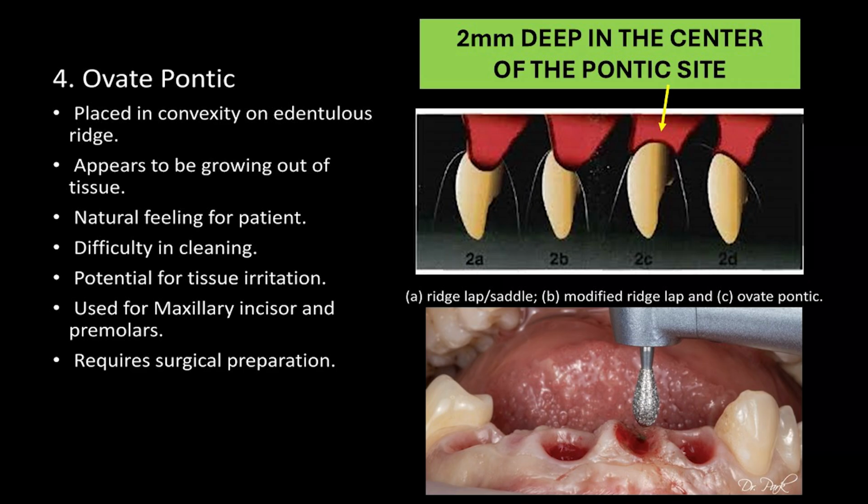To create an ovate Pontic, like you see here, they just don't automatically happen. Doctors have to go in with a diamond burr, usually, and they have the bridge that we made, and it has the ovate Pontics on it, and we have ovated the model that the bridge comes on, so the doctor takes one of these burrs and he goes down in and shapes the gums so that the bridge can seat with this burr.